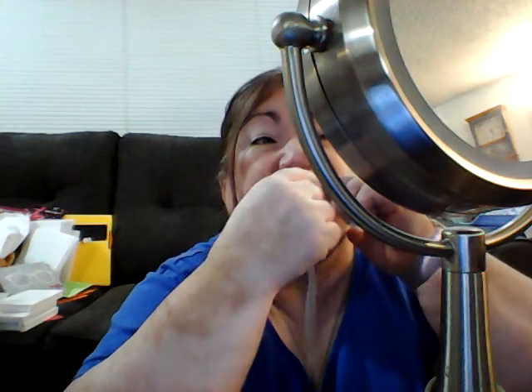Again, like I said, my top one is my hardest. I don't know if I can get it in or not. Let's see. Oh, I did. Okay, so I got my top in. Okay, again, you want to go down. Just go along and kind of saw. Okay, go to the side, get that implant, other side, get that implant, pull it out.